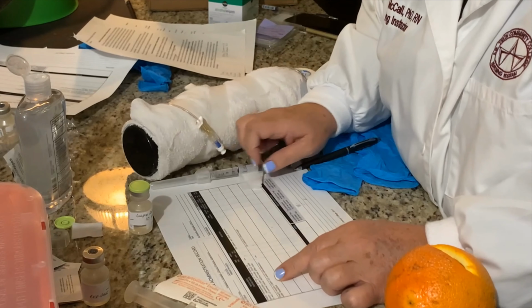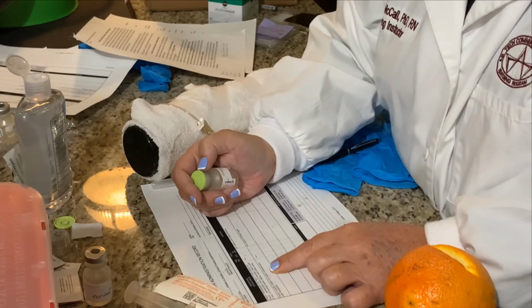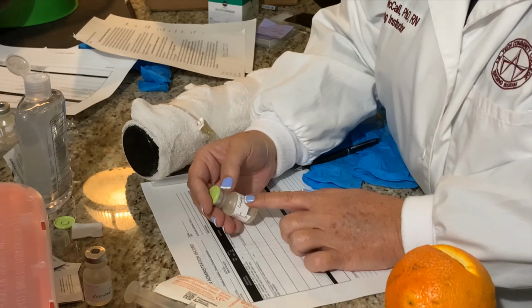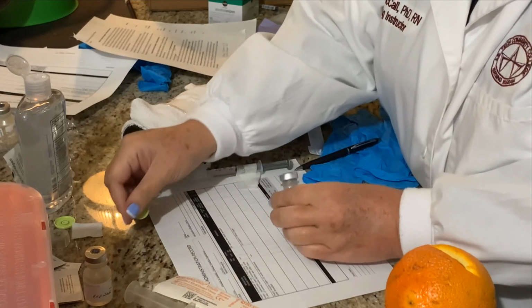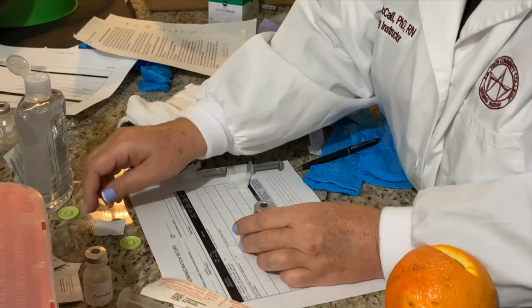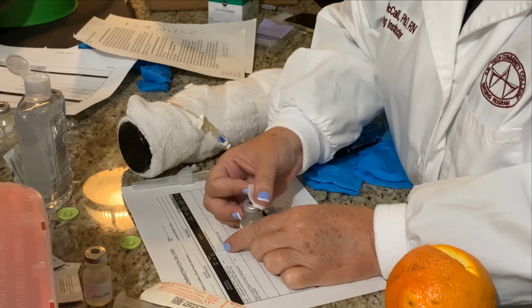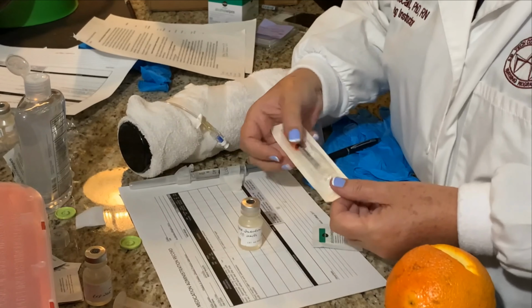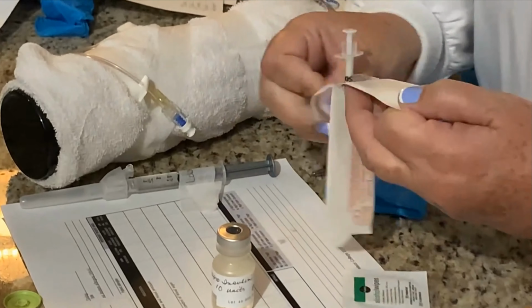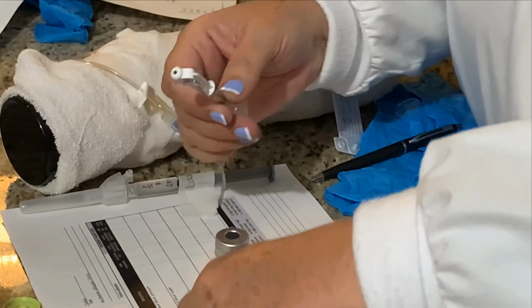Okay. So the next one I'm doing my second check now with my insulin. I have Lispro 10 units sub-Q. Lispro insulin. And it expires 2025. So now I'm going to pop my top. Got a new alcohol swab. Scrubbing it for 5 to 10 seconds. I have an insulin syringe. Insulin syringes are usually orange. They're easy to spot. I'm going to pull my cap straight out.